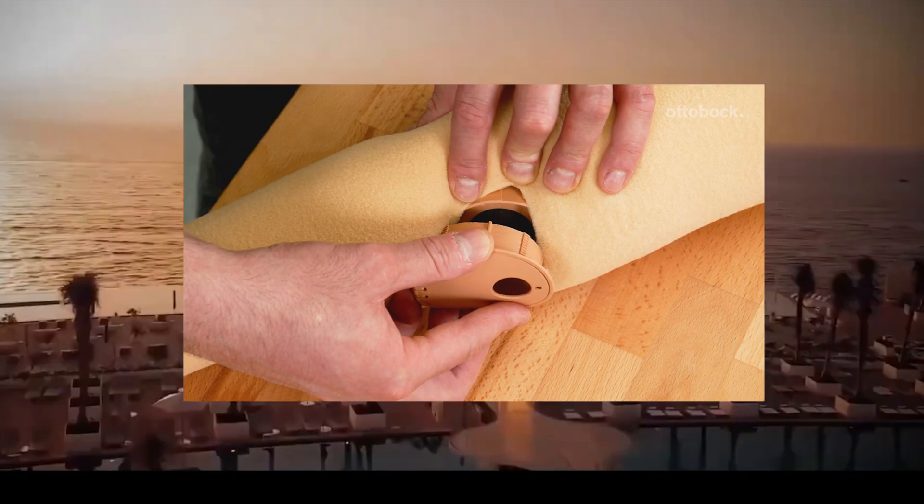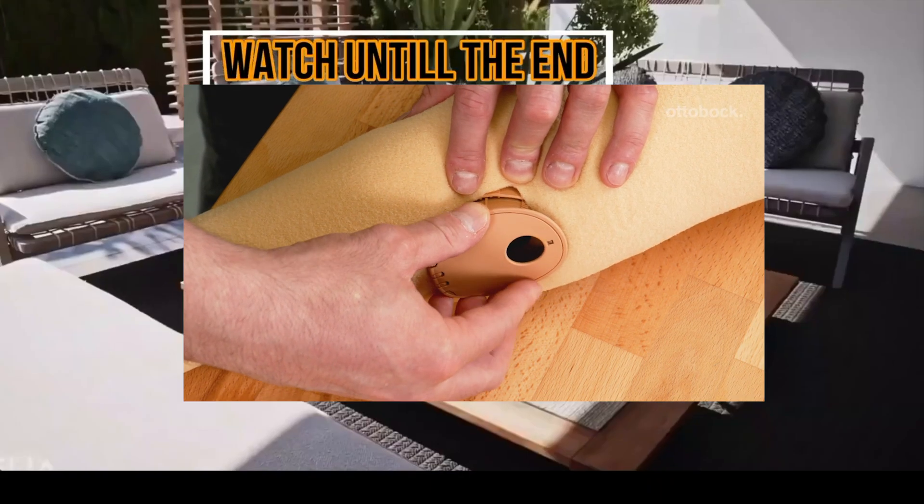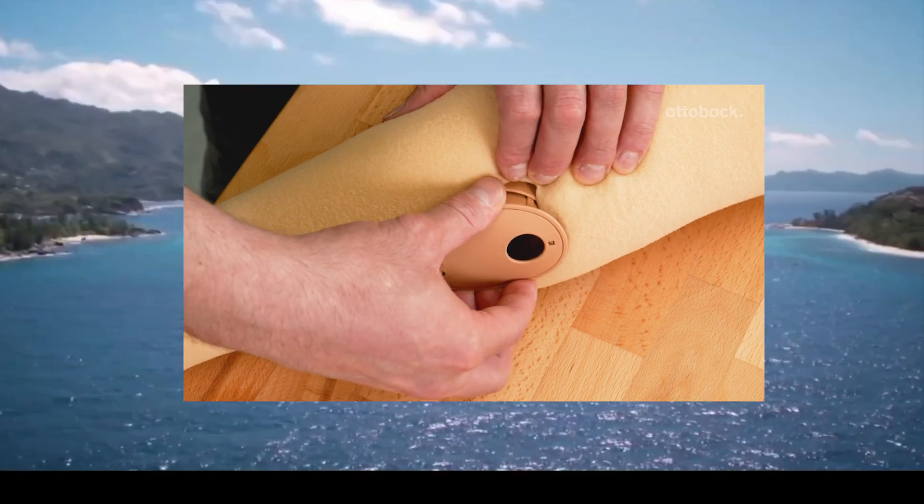To lock the charging shaft into position, gently turn clockwise. Care must be taken not to push in or pull the charging shaft, as this can damage the interlocking.